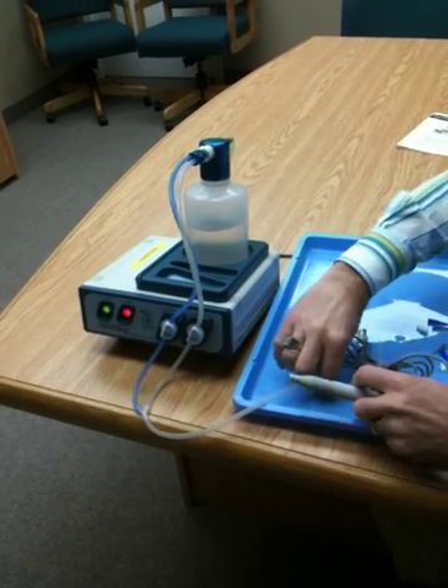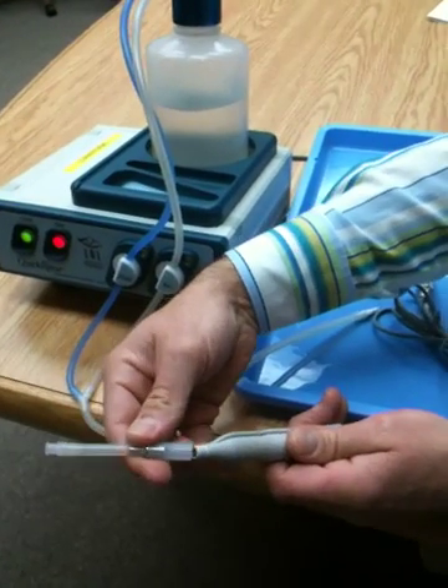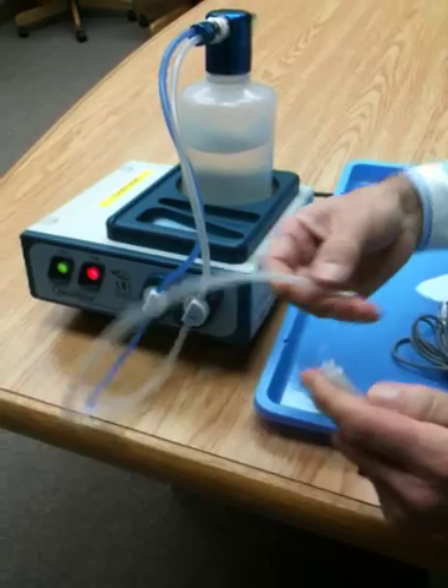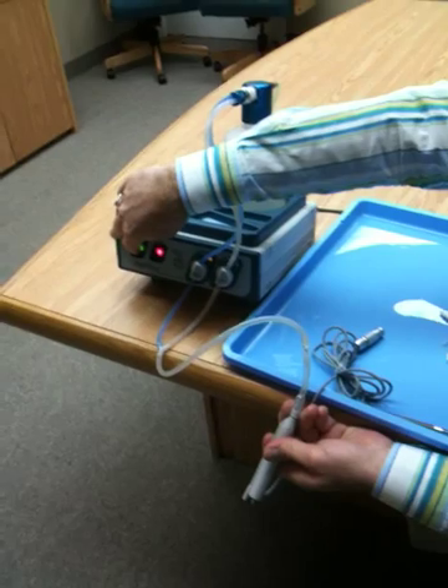For FACO handpieces that require reverse flushing from the nose end, there is an adapter available that fits over the nose. You simply hook this up with Luer adapters and you can do a reverse flush this way.